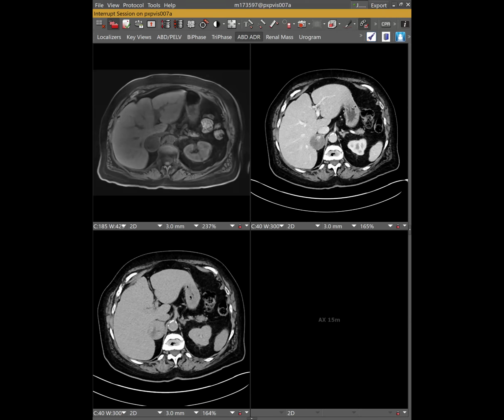As a caveat, I had a very similar case and it was a lung cancer met. We just kept calling it a bleeding hematoma that was increasing in size. And it came back lung cancer met. So I'm a little cautious these days, but wait, so why was there FDG avidity? I must have been assuming something viable. It's just blood. It was similar to blood pool for the FDG avidity. It was filling with blood.